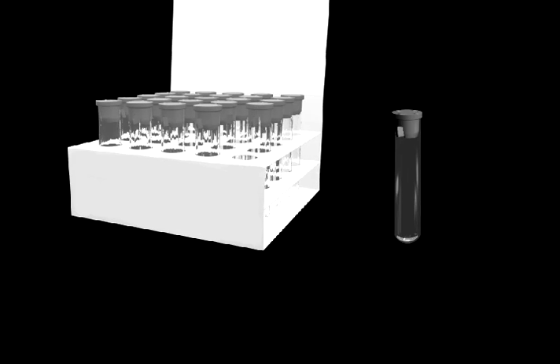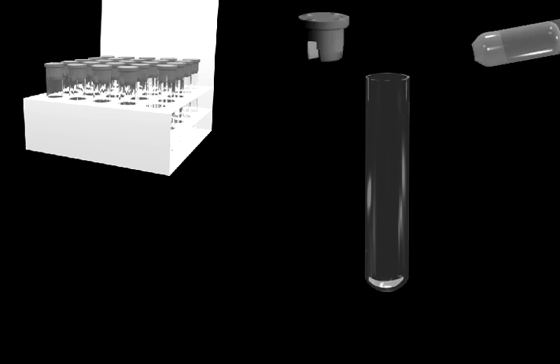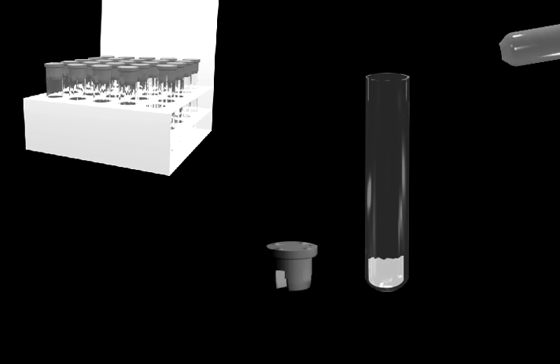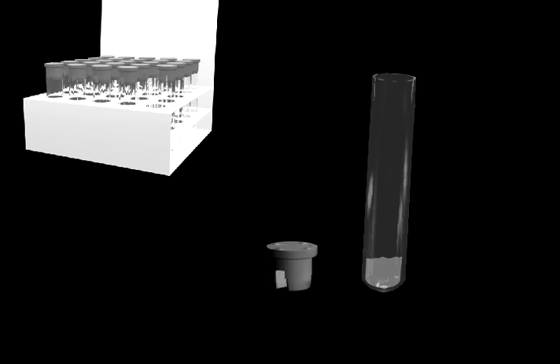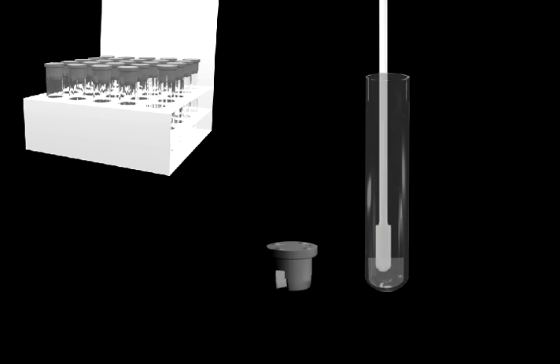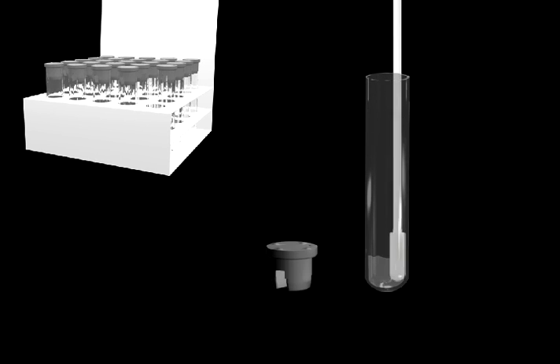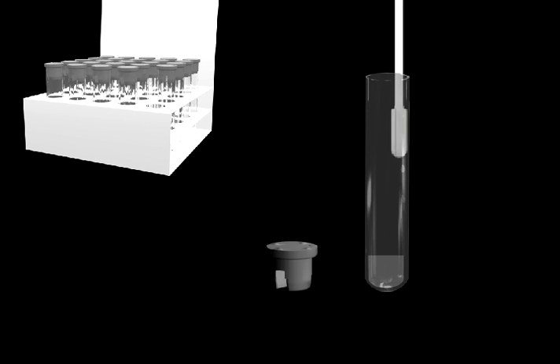The test procedure starts with the addition of the extraction solution to the extraction tube. The swab is then inserted into the tube where virus particles are transferred into the solution.